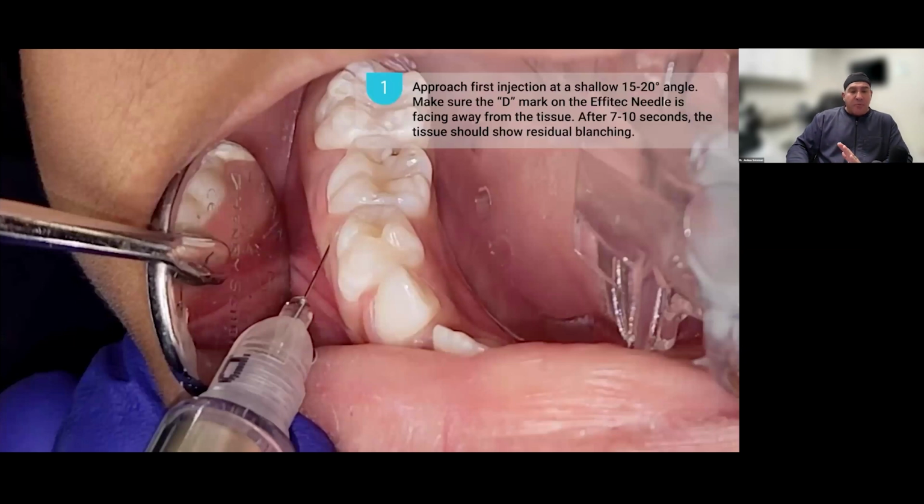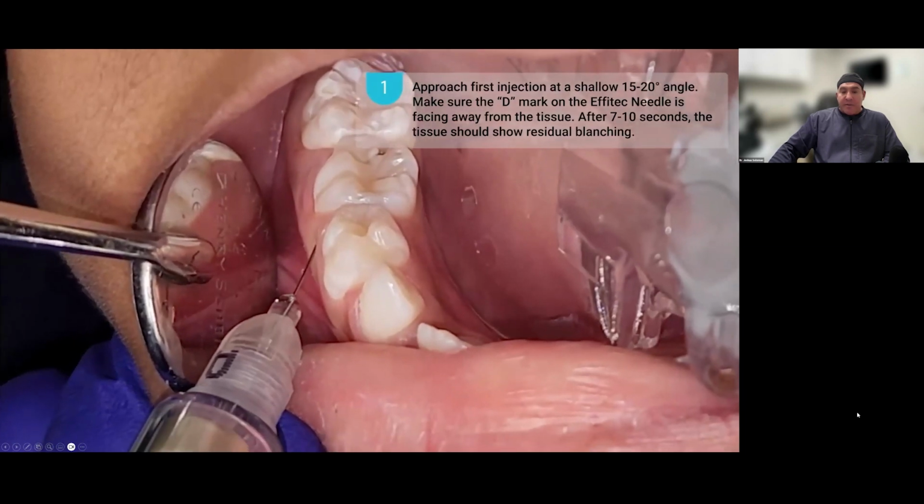Paul Bond shot this video. I think it's one of the best that we have. The one caveat for those of you that are not new is that you see he's holding his syringe in this example not at the base of the hub. That's just to shoot the video so you can see. But let's go through this and you can see the three steps of delivering local anesthetic.